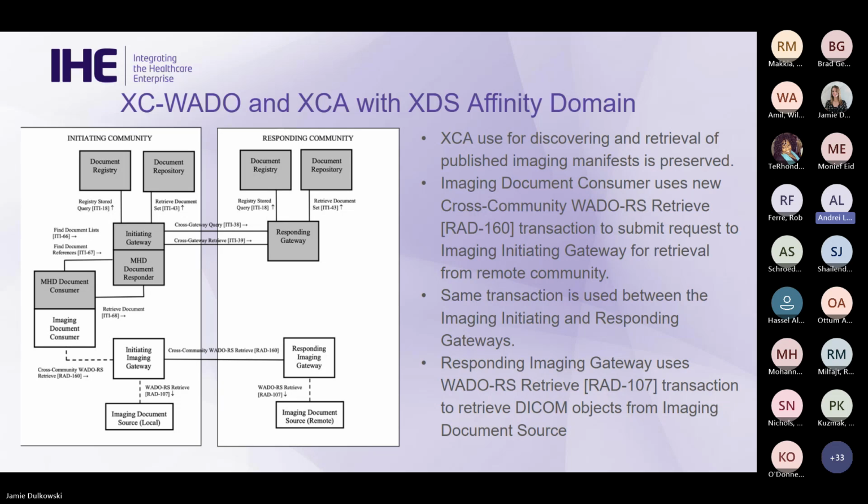So here's an example. We can implement the XC-WADO alongside with XCA with XDS affinity domain, or it could be in association with the MHD domain, or a combination of both, or whatever that might be. The gray part on this diagram is an example of how things could be structured, but they are not part of the profile.